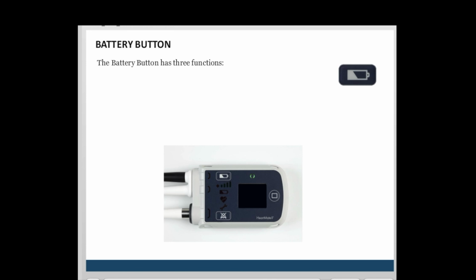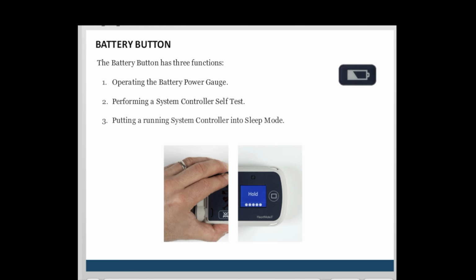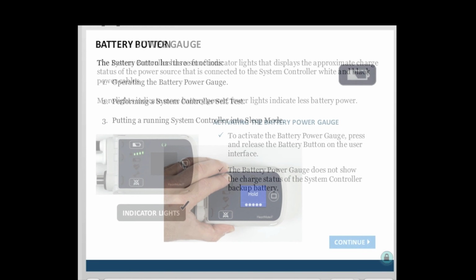The battery button has three functions. Function 1, to operate the battery power gauge by pressing and releasing the battery button. Function 2, to perform a system controller self-test by pressing and holding the battery button for 5 seconds and then releasing it. Function 3, to put a running system controller into sleep mode when the system controller is no longer in use on the patient.